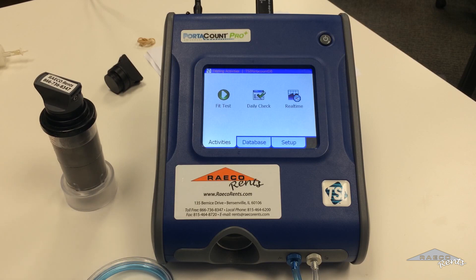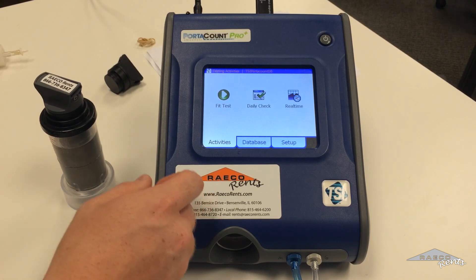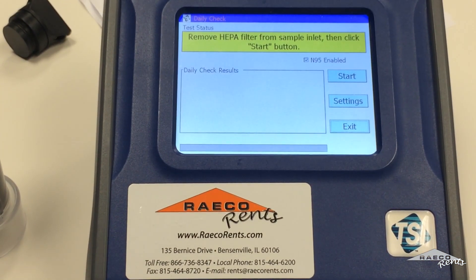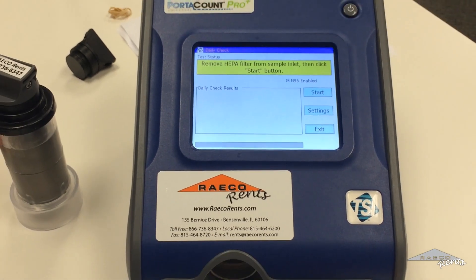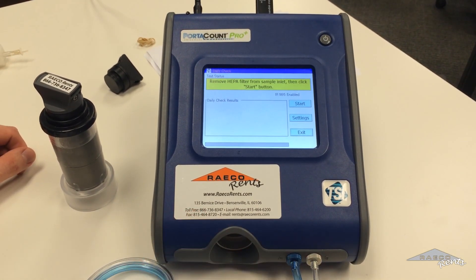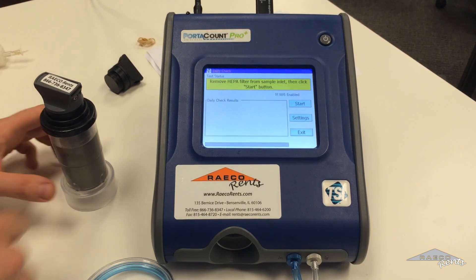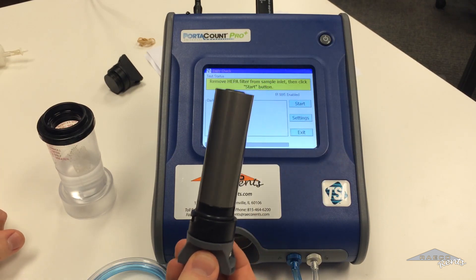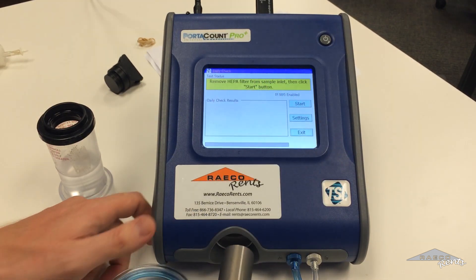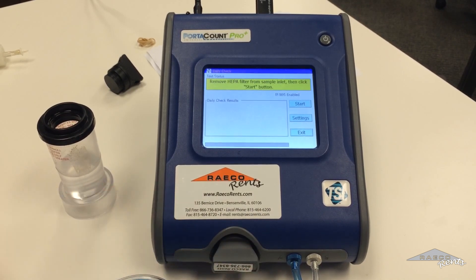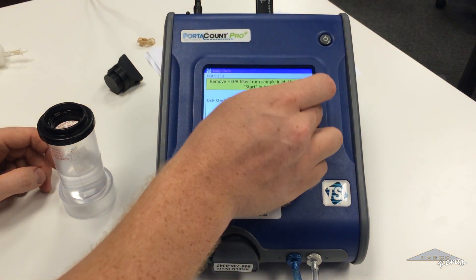Now we've got your database set up and we're almost ready to run the fit test. First, we've got to do our daily check. On the main screen here, hop into the daily check. Make sure you've got your tubing set up — your blue tube connected to the blue inlet, and your clear tube connected to the silver. Then we've got to put in this alcohol cartridge. Make sure you soak that in alcohol before you put it in, just put it in and give it a turn — it'll lock in there. Then we're just going to hit start.